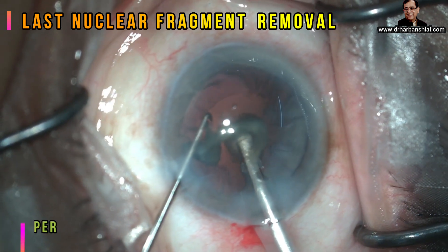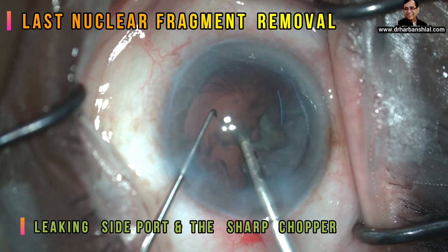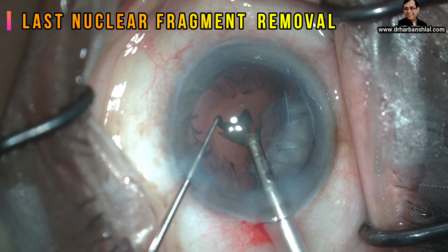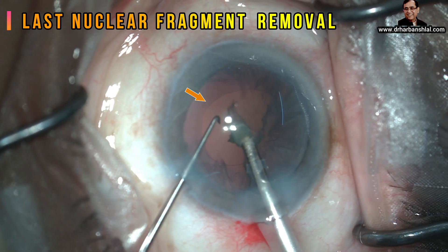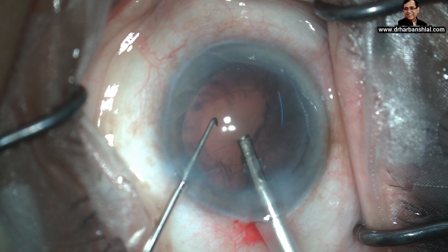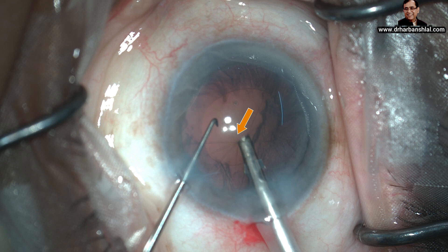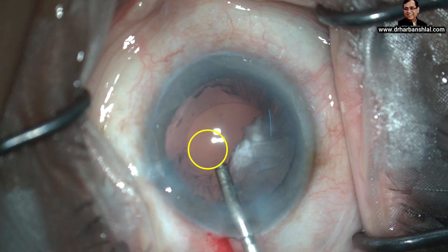Note the leaking side port and the use of a sharp chopper. As soon as the capsular fornices are empty, the posterior capsule has a tendency to move forward. Watch how the capsule is moving forward. The posterior capsule can be seen caught in the phaco tip, and folds appear in the posterior capsule leading to an inadvertent posterior capsular tear.